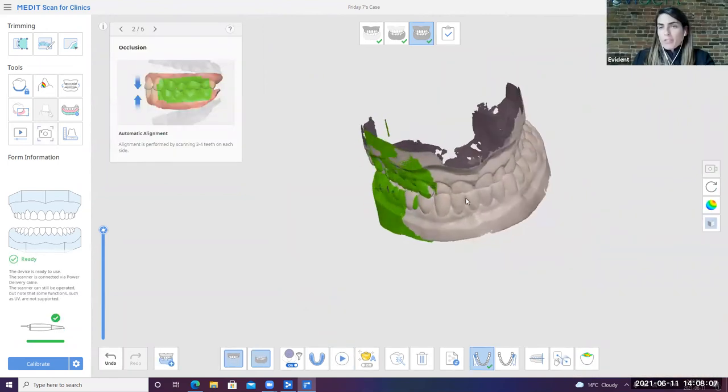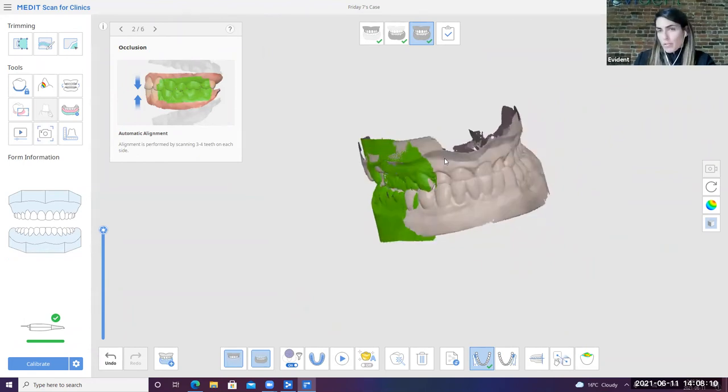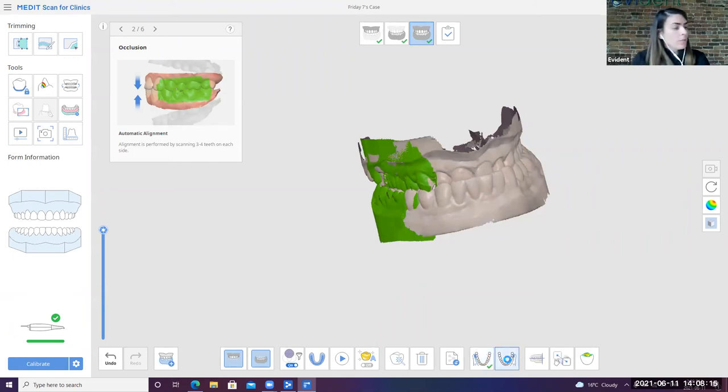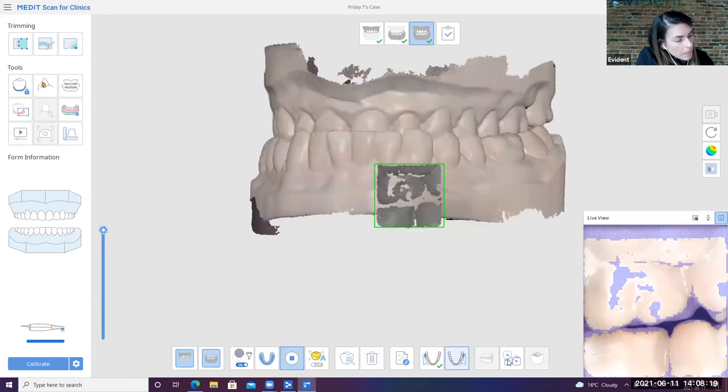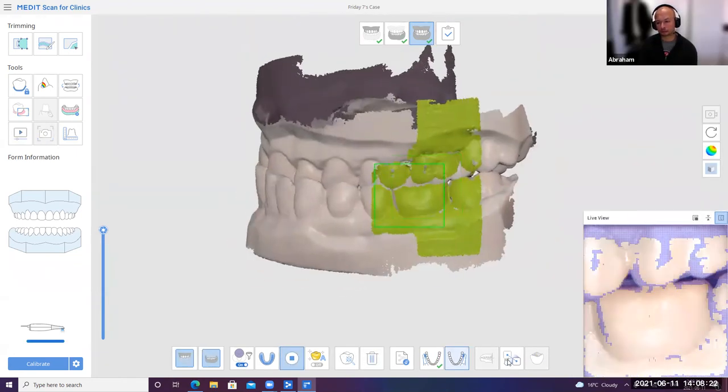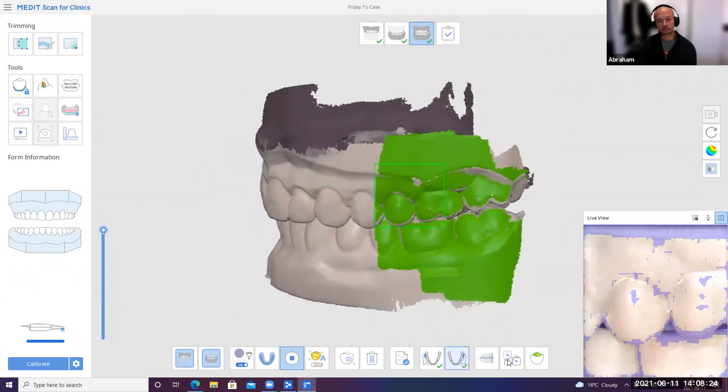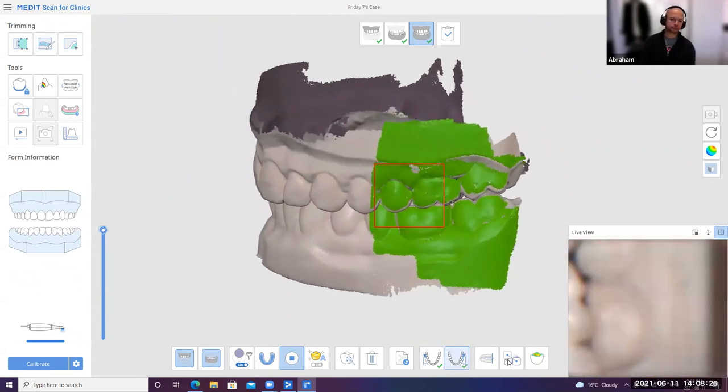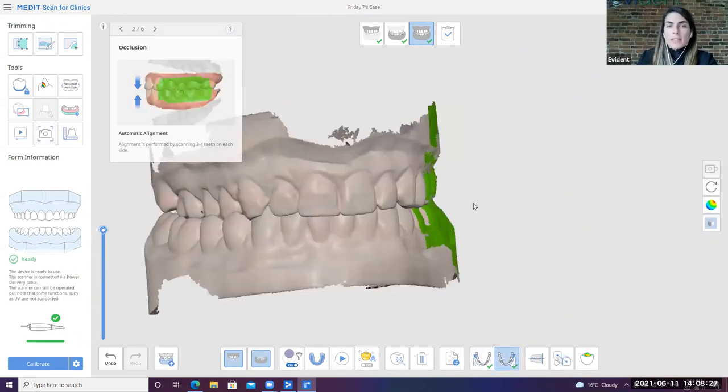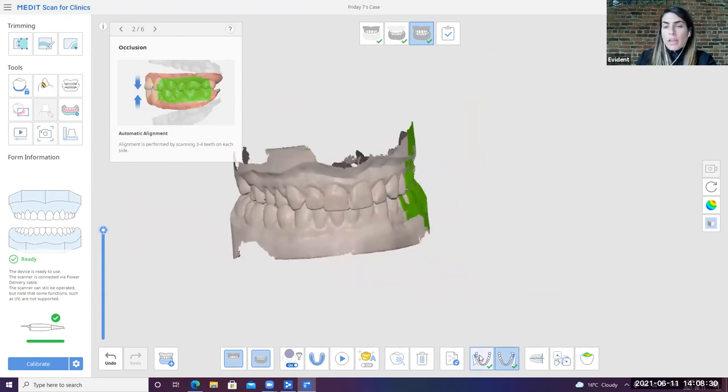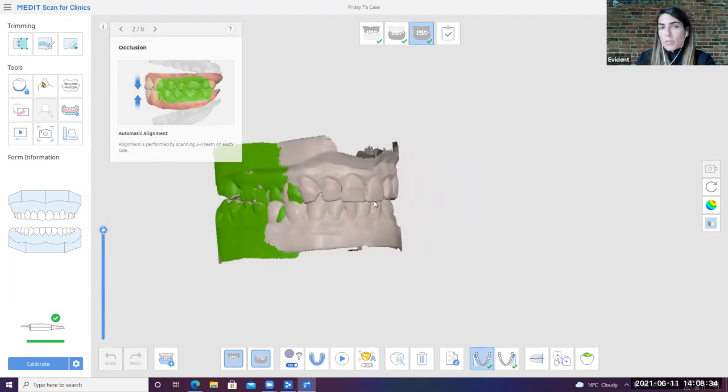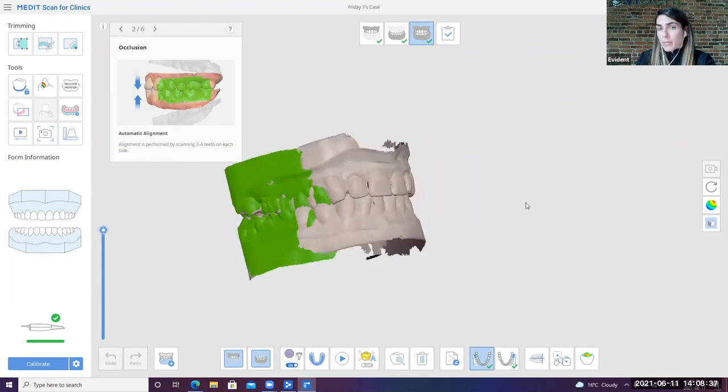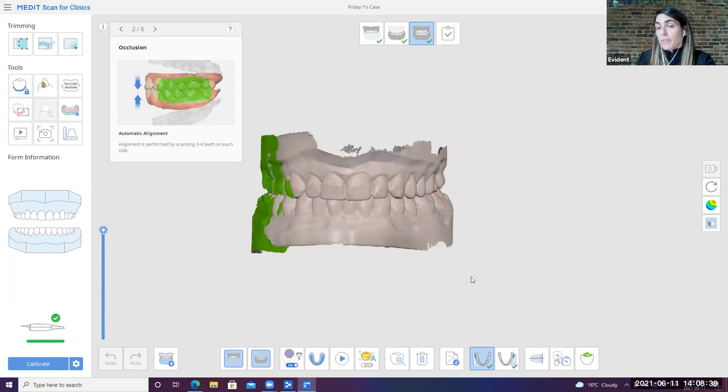So you can see here that we have a discrepancy of the bite points. My models, I do not have it right. So I'm just going to go ahead and actually change onto the second occlusion here. And I'm going to try my other side and see if I can get it to align. Perfect. So I can see here now my alignment looks good. Everything looks great. So I'm going to actually pull onto my other side here and just double check that it has been improved with that secondary alignment. So I now have the same bite with both sides here.